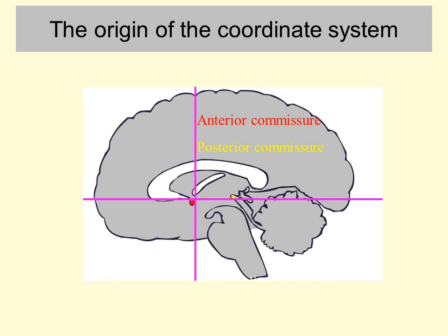When I began doing brain imaging myself, I used the SPM software, quite an old version of it, and in that software you had to look at the T1 anatomical image of your participant and manually set where you thought the origin was, i.e. put it on their anterior commissure by clicking, whereas the modern version of FSL, the thing you're going to use, automatically uses image processing to set the origin for you, which is fine, but I actually think it was quite nice to have that kind of interaction with your data and to get to know really where the origin is by having to set it yourself.